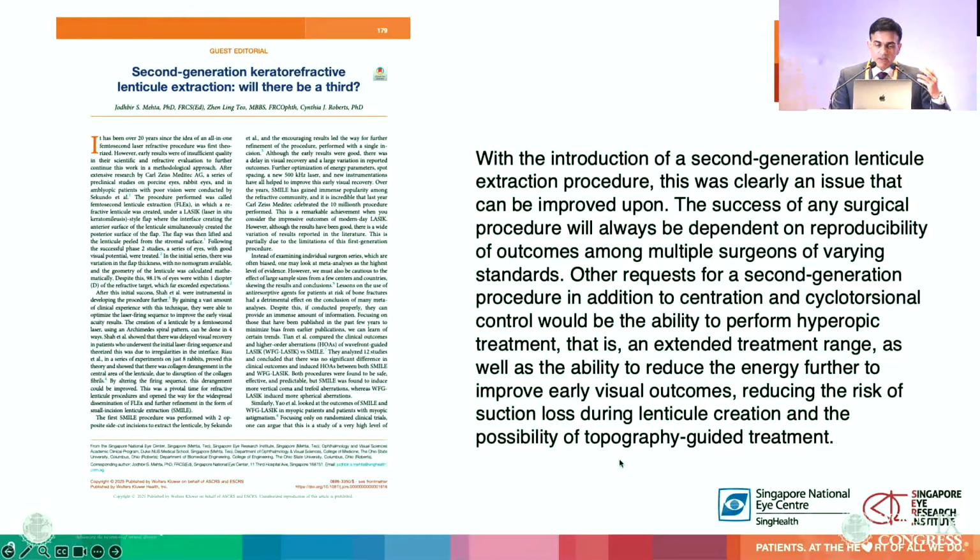We need to really think about, are we going to be able to do topography guided treatment? And this is what to me is one of the massive advantages of an excimer laser, able to really match your topography with the profile of the excimer beam. So is this possible with current lenticule extraction technology?